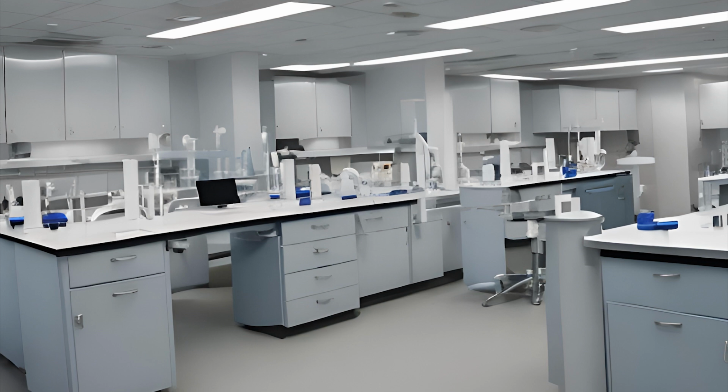Specimens for plasma that are collected in tubes that contain anticoagulants typically can be centrifuged immediately. You're not going to have to wait for them to clot because they're not supposed to clot. So oftentimes you'll get heparinized plasma instead of serum when you need to run a chemistry test that's stat. Or your facility may just do that as a routine policy to reduce turnaround times overall.